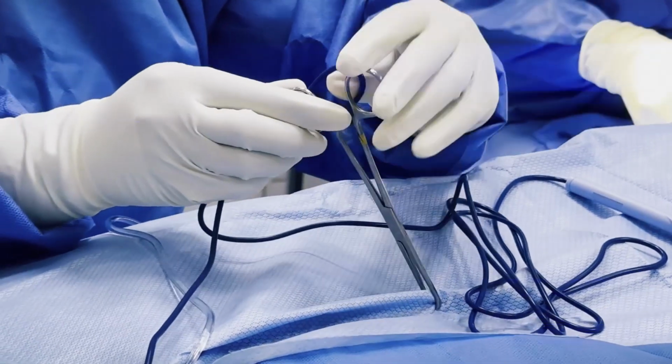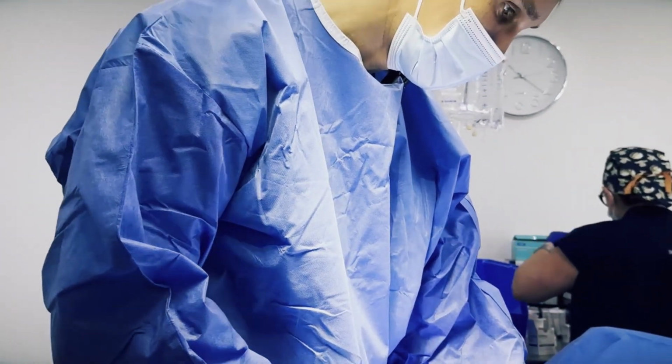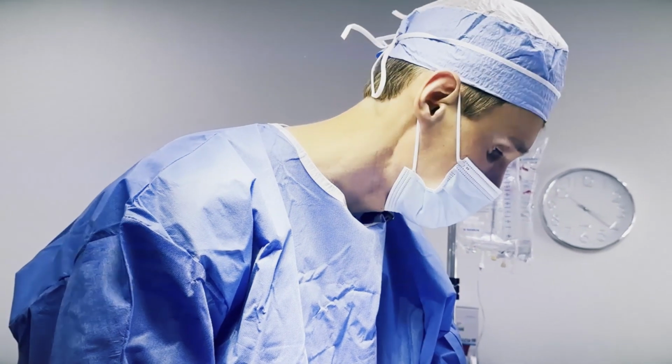I'm going to continue with the infiltration of the solution under the skin with the pedal. It's a pump that I operate with the pedal. And we're just gently infiltrating. We switched to a new bag, right? Yes, sir. Good.